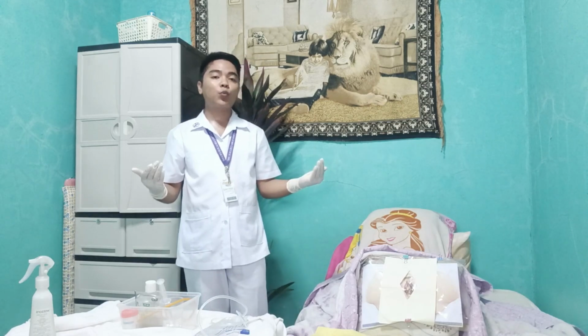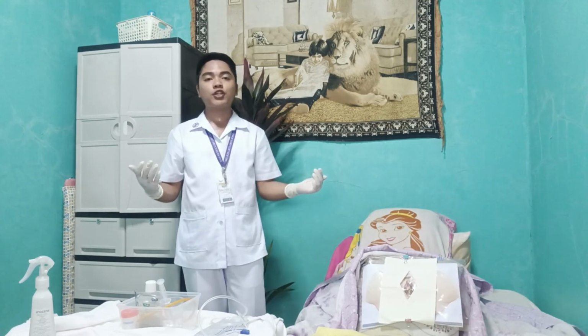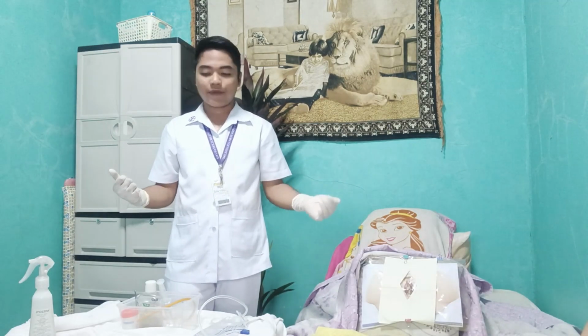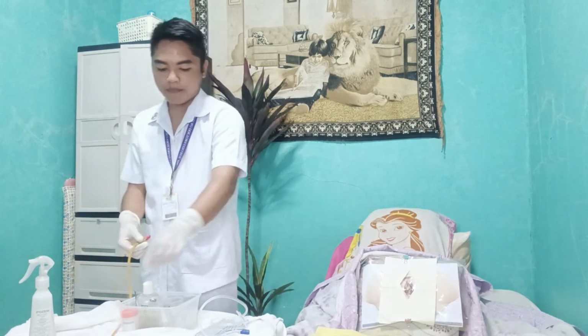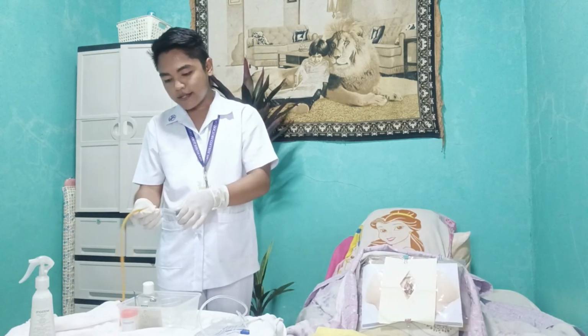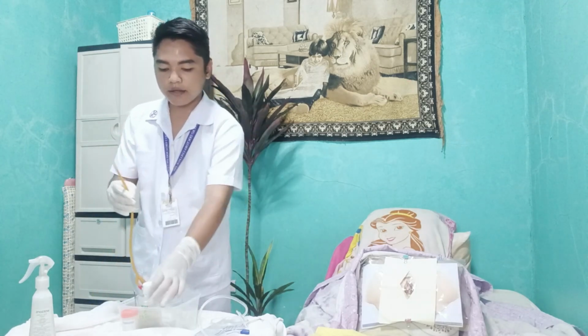Now I am going to connect the catheter with a pre-filled syringe and lubricate the catheter for about 1.5 inches. This is done to reduce discomfort and friction, which in turn will reduce pain upon insertion, infection, and dilation of the urethra. Checking if it's really 10 cc. Insert. Then after inserting, lubricate.